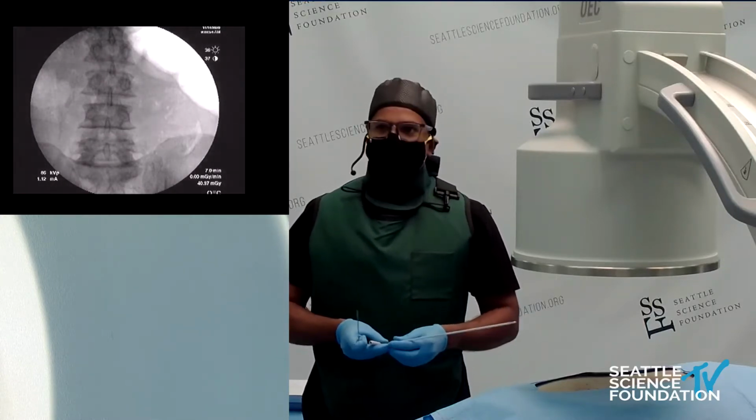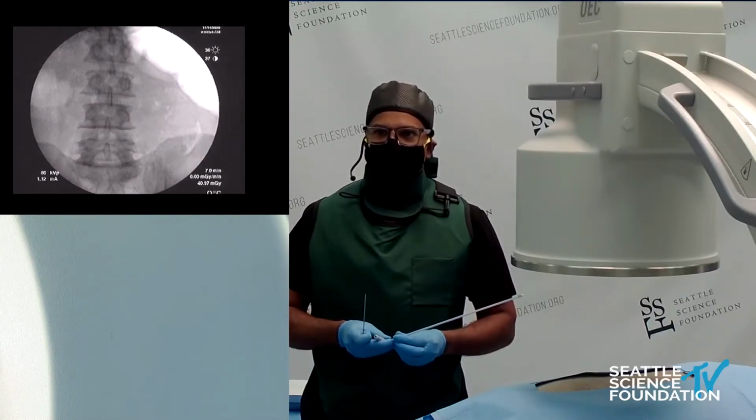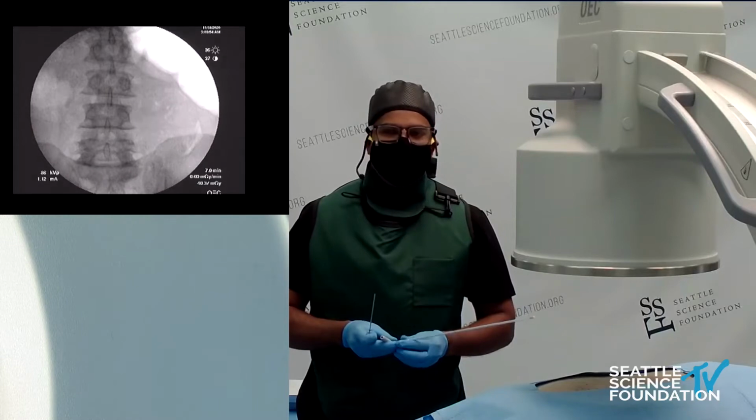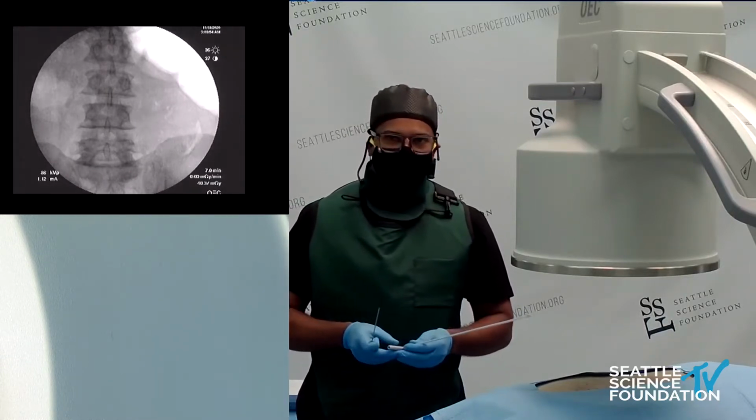This technology has a long history. Its roots began at Stanford University and then evolved into the company Spinal Modulation, which was acquired by St. Jude, then became Abbott, which, as I mentioned before, is the only FDA-approved DRG stimulation company right now.